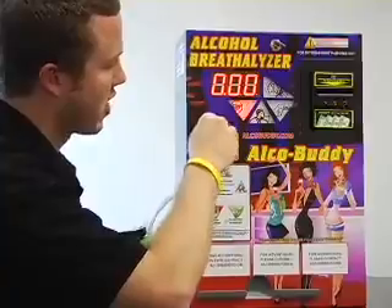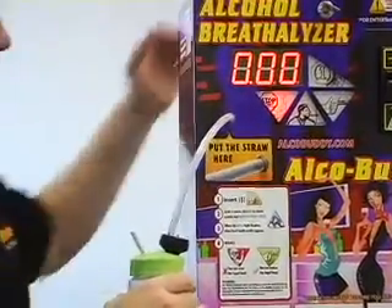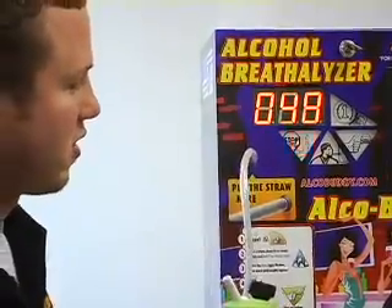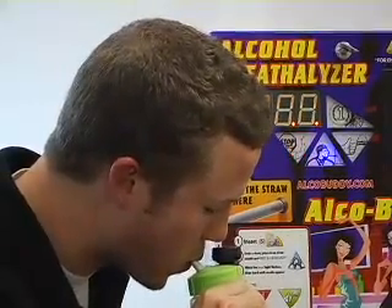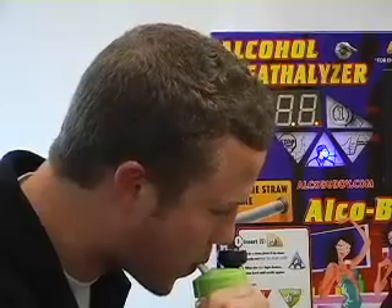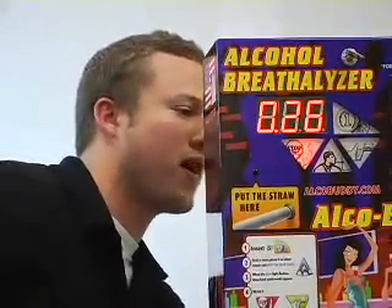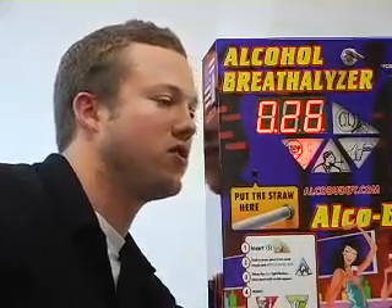No one blew in there so it came up zero. We'll wait for the next countdown and give a nice thorough blow for a few seconds. The 10-second countdown is running — as you can see it came up 0.26, so it's a little low. I'm going to adjust the screw, turning it clockwise about half a revolution, and we'll see if that does it.